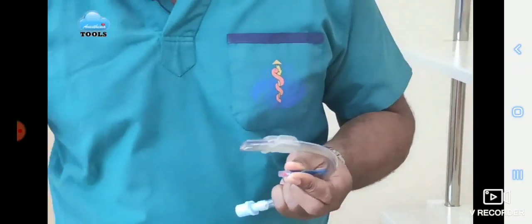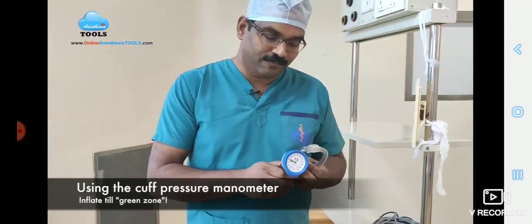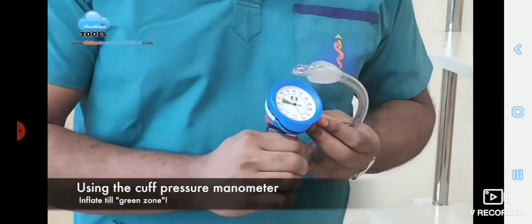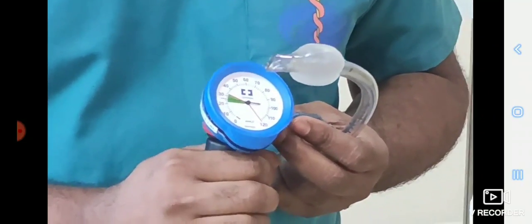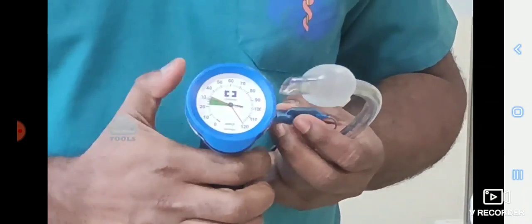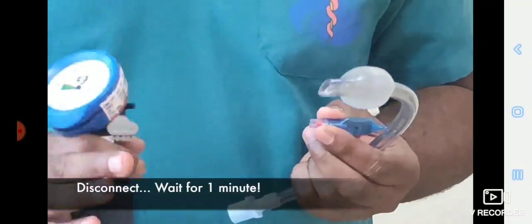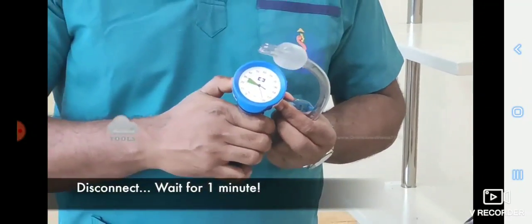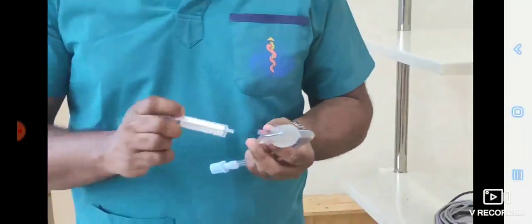If you have a cuff pressure manometer, you can use it to inflate the cuff as well as to regulate the inflating pressure of the cuff. Here you can see the green zone indicating correct cuff pressure. Again, disconnect, wait for 1 minute to look for slow leaks. If acceptable, deflate the cuff completely.